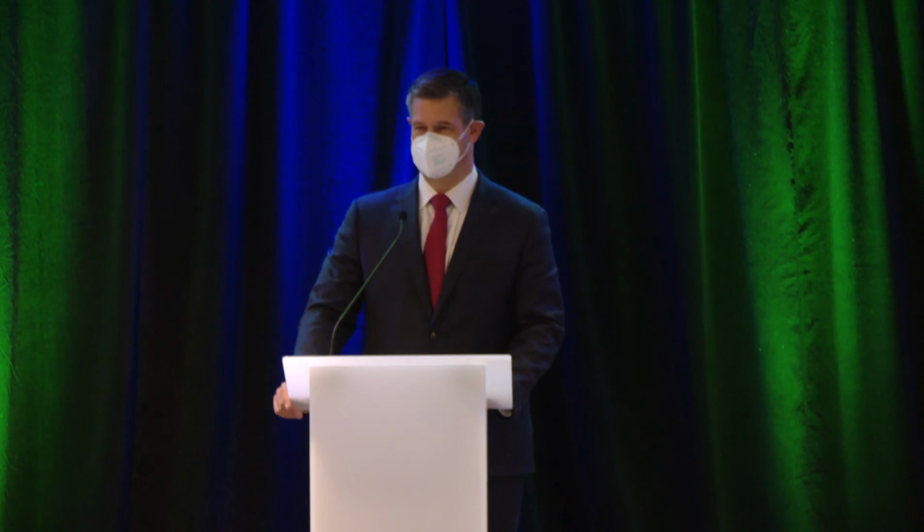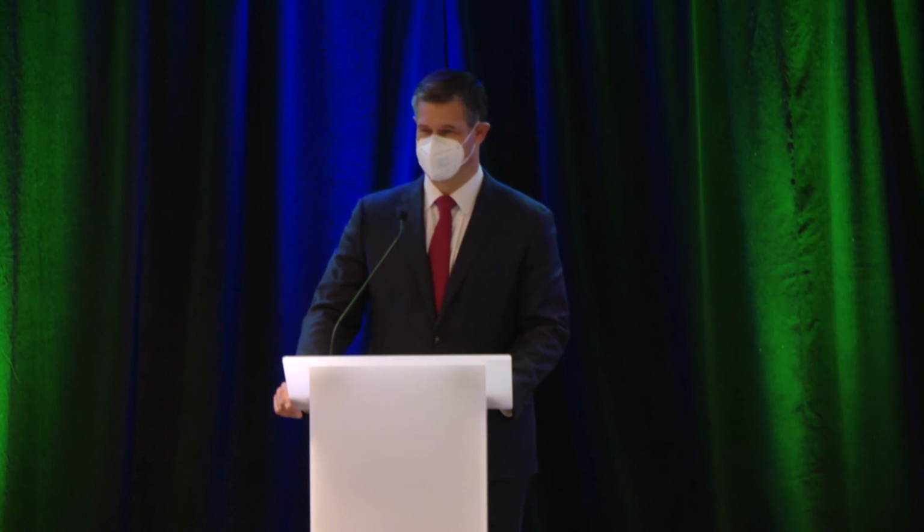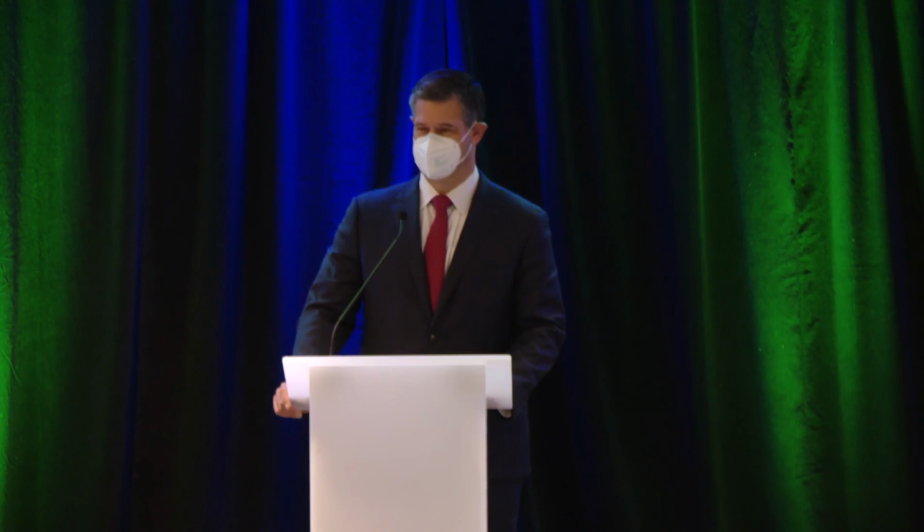Actually, in reality now, one of the things I've seen, and we've talked about but don't write about, in HRM, is that it's best to analyze from the last swallow to the first. Because if you've done it right, you've gotten the patient trained in all of that. So it's not really unusual if you look at it: those first 3 or 4 swallows look really weird, and then everything smooths out. So I don't think you necessarily have to use a rule of 10. I like to use maybe a rule of 15 until I get things settled down, but that's kind of an old guy talking. But I do think that motility is basically as good as the nurse is spending time.